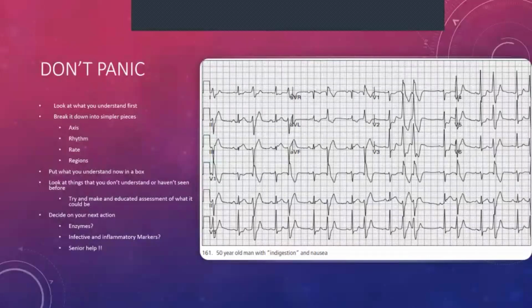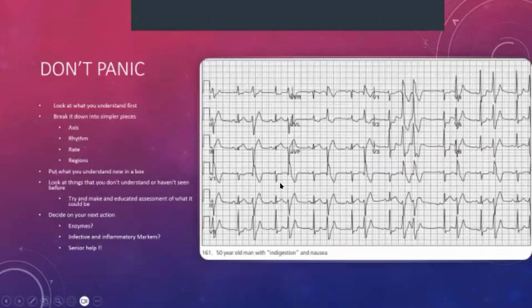And then you go and look at the things that you may not have seen before, which I know doesn't make much sense now, but then I'll explain to you how we'll go through it, right? So you try and make an educated assessment of the things that you don't know based on the knowledge that you have, and then you decide on your next action.